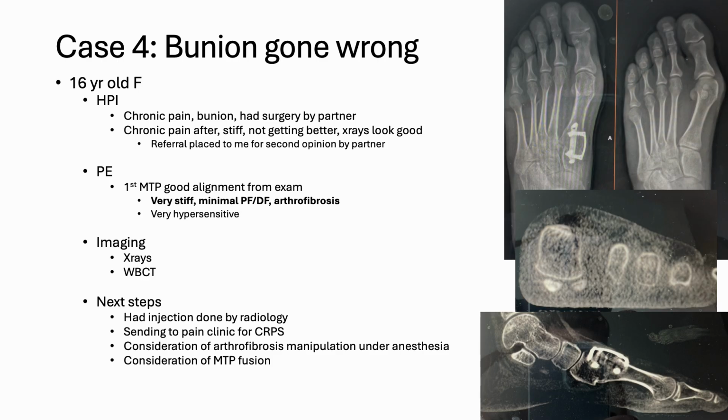And then I said if none of that works, we could always consider doing a big toe joint fusion. Now the youngest patient I've done a big toe joint fusion on was about a 21-year-old after she had a failed bunion when she was 16 and it went on to be really arthritic. So I've done that in the past. It's not something that I usually tell my patients I'm super adamant to do. But this is an example of me knowing that I love weight-bearing CT scans. I think my study proved with our group that there's sometimes something abnormal about patients, and we would never know that just based on an X-ray.